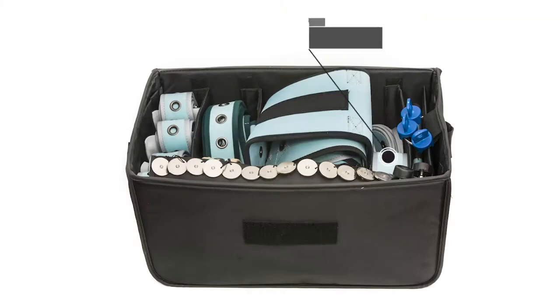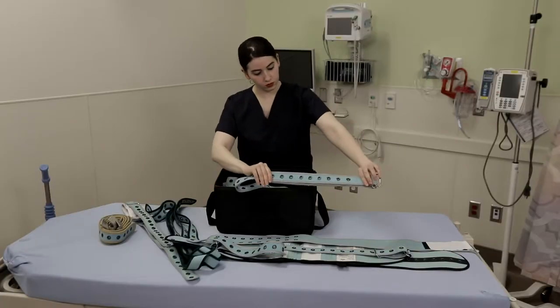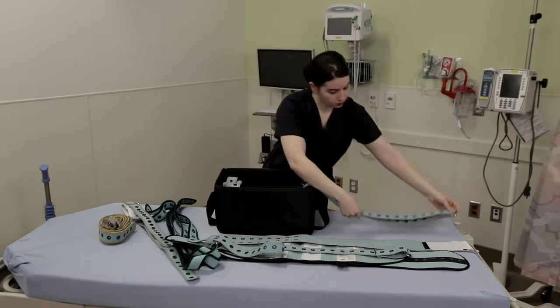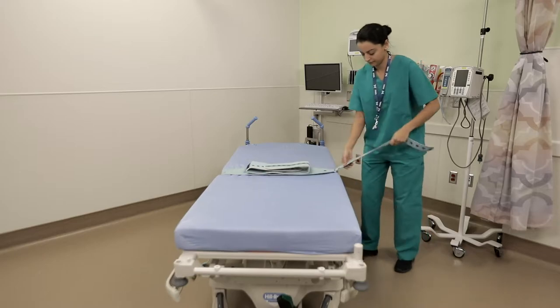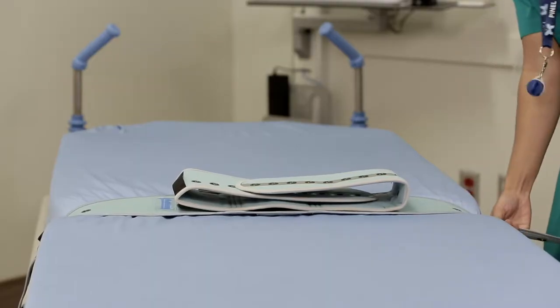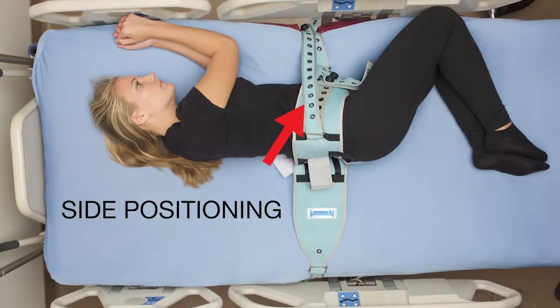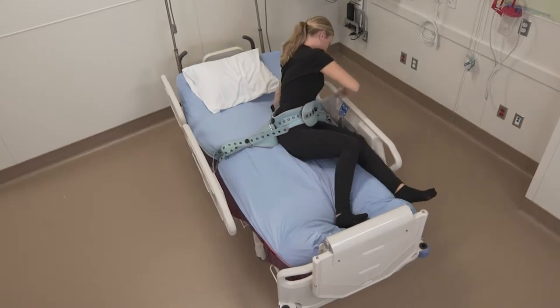This same slot also contains two additional small utility straps which can be interchanged with the two straps attached to the waist belt. The following applications show the versatility of the small utility strap. Four of these straps arrive with the waist belt and are interchangeable. Two are used to attach the waist belt to the bed frame. The other two control rotation of the waist belt, allowing you to position a patient on their side or prevent the patient from rotating in any direction.